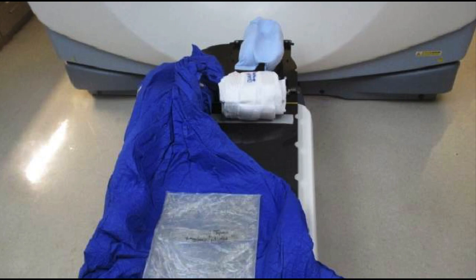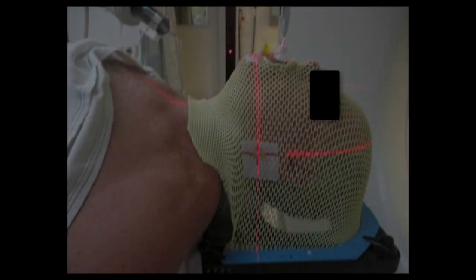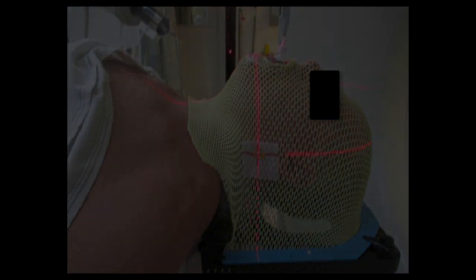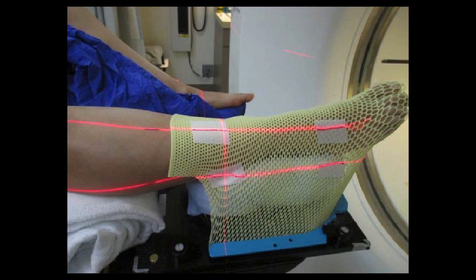Because this is such an important issue, a wide variety of devices have been developed, and it's beyond the scope of what I can lay out here to describe them in detail, but it's probably worth mentioning the Aquaplast material. That's a thin thermoplastic material which you heat up and then molds to the patient. When it cools off, it solidifies into a semi-rigid shape. You can see there's holes here, and that's to prevent the extra bolusing effect in the beam. This material can be used in creative ways to achieve the immobilization that you need.